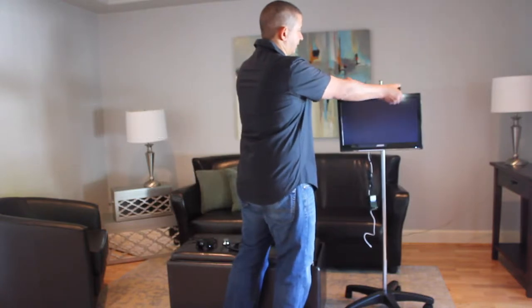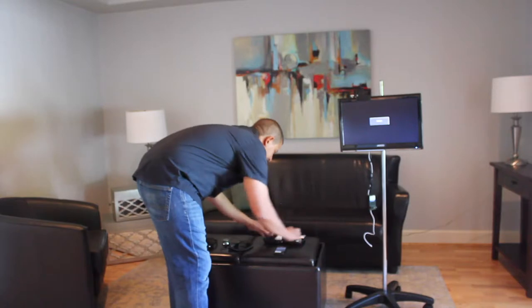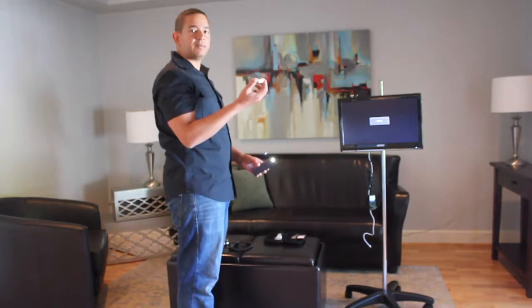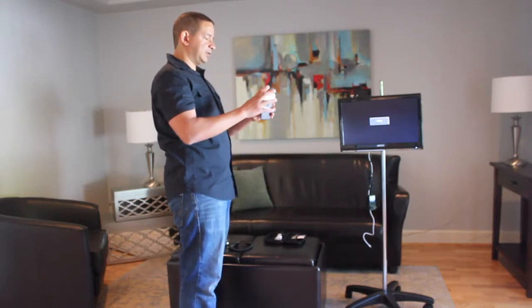You pull the handheld device out like this. In your kit, there should have come an adapter. It can be white, black, or blue. This adapter will fit right over the screen like this.